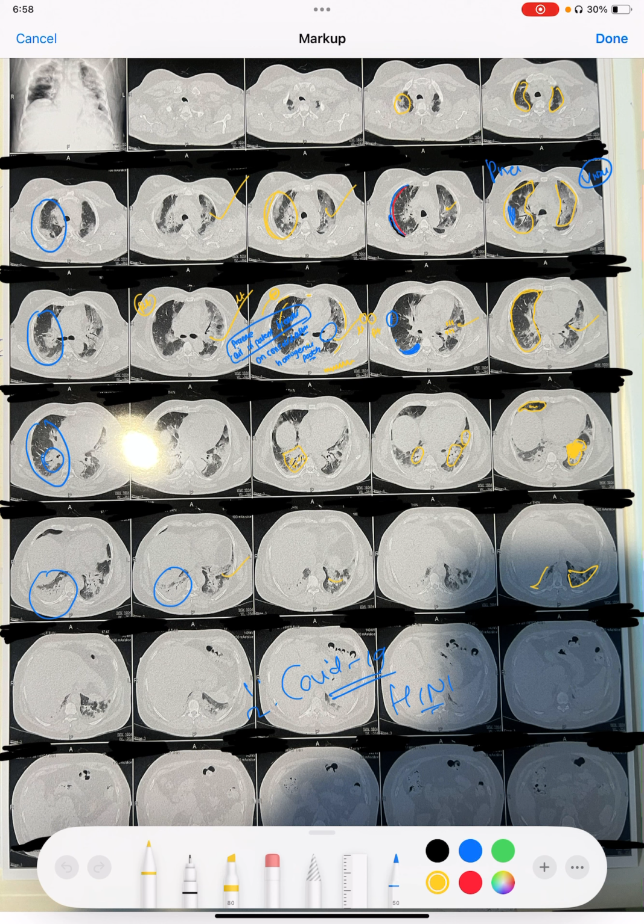When it comes to a comparison between viral pneumonia and bacterial pneumonia, viral pneumonia very commonly involves almost all the lobes, whereas bacterial pneumonia usually involves only one side of the mediastinum. Either it will be in the left or right. Usually the patch will be very large if it is a bacterial pneumonia. It will be almost unilateral.